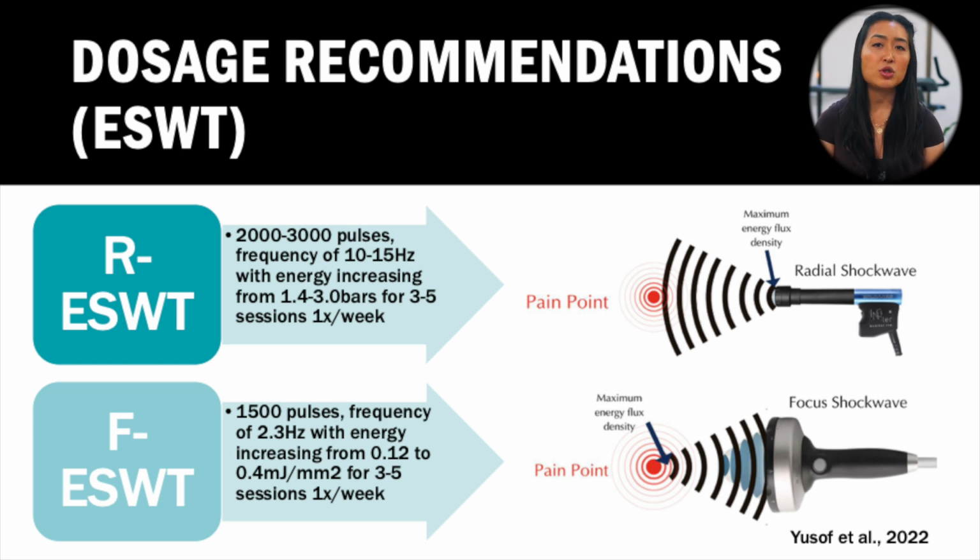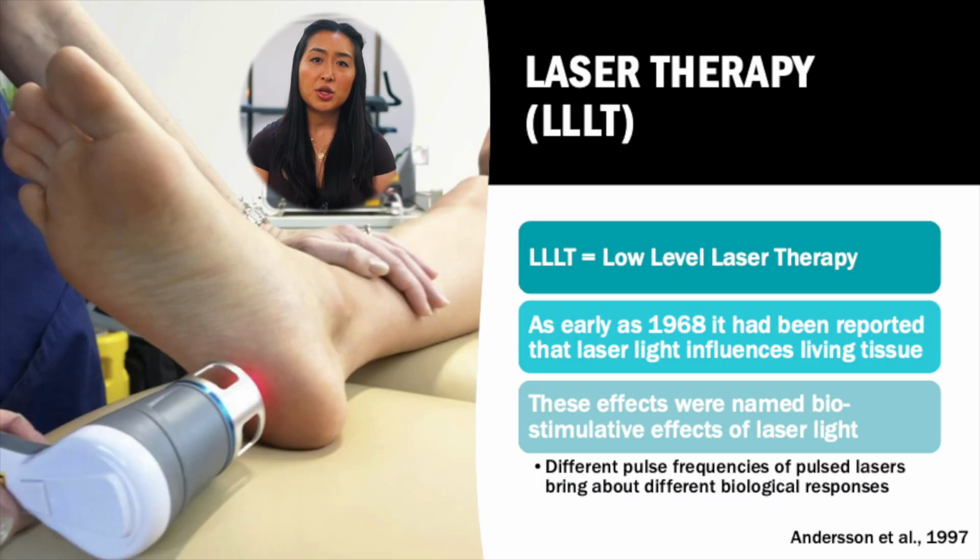I personally don't use focused shockwave therapy, so I can't speak much behind these parameters, but they are on the slide if you're interested. So now we will move on to laser therapy.